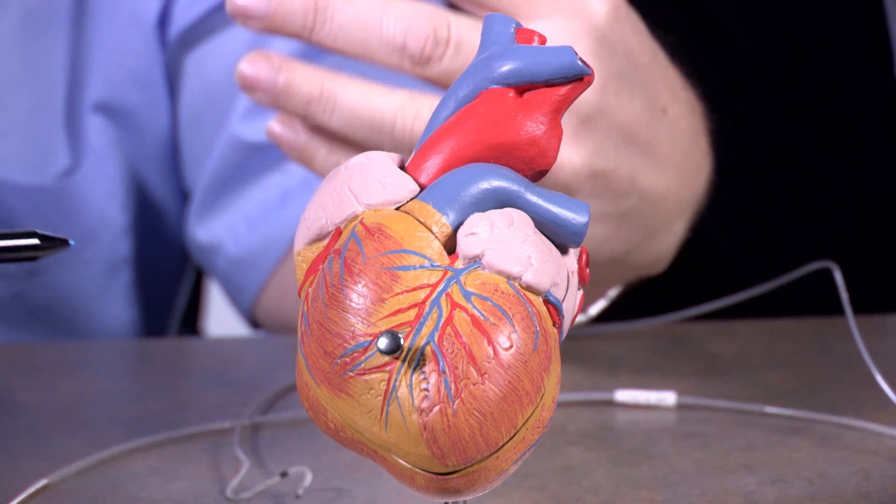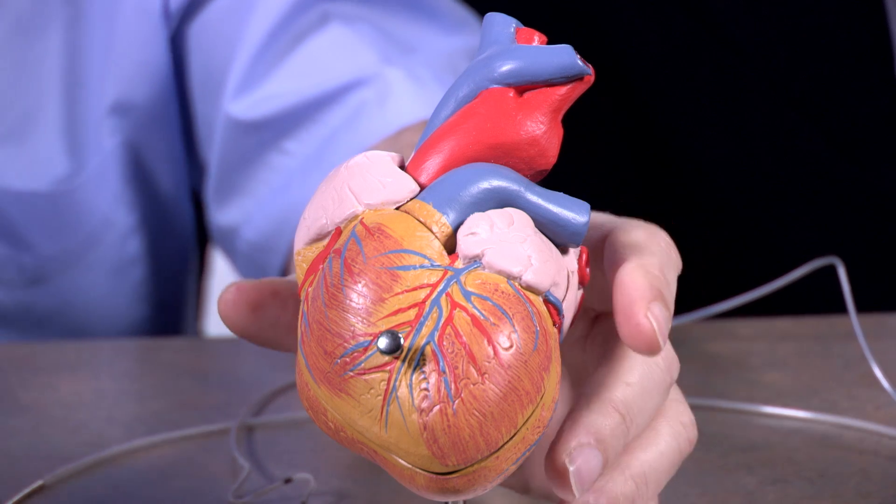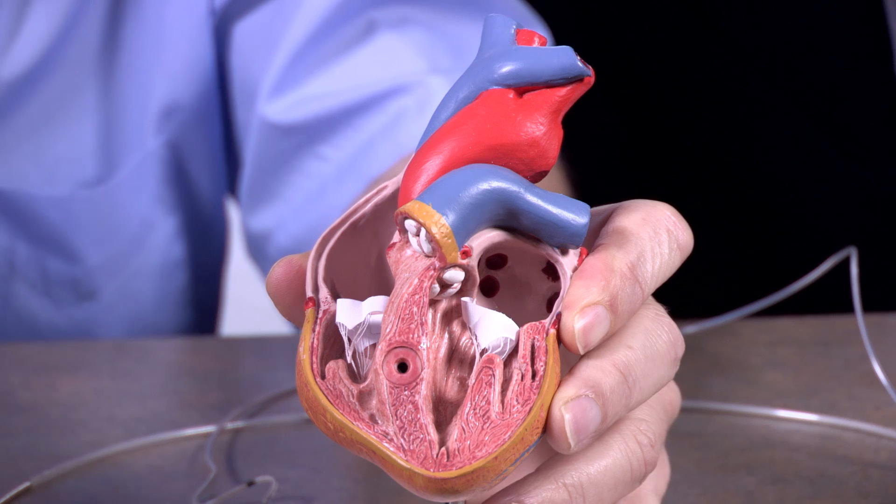In this video, we'll give you a little background of what Lab 7 could actually do. So here's a heart, and let's open it up — it's just a model. Take off the cover here, we don't need that anymore.